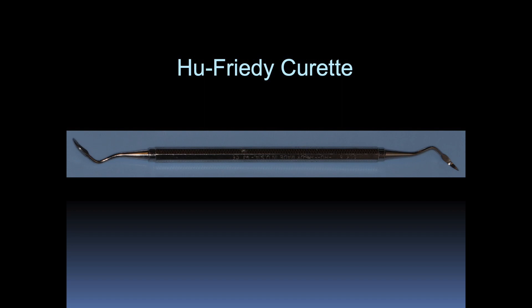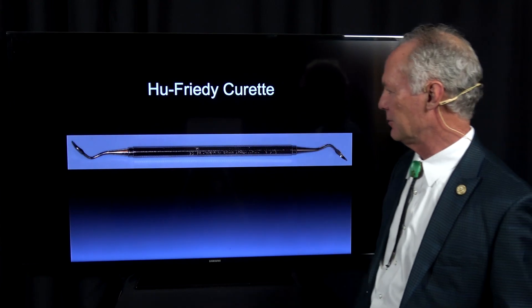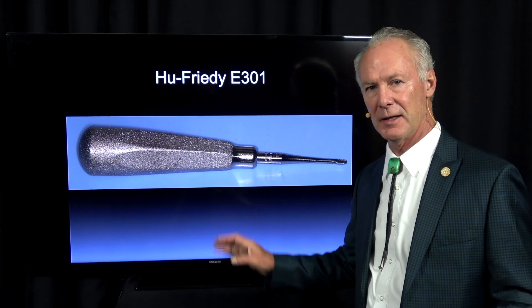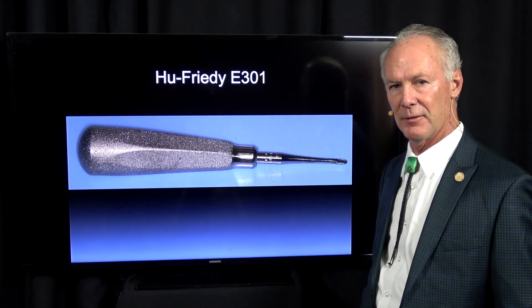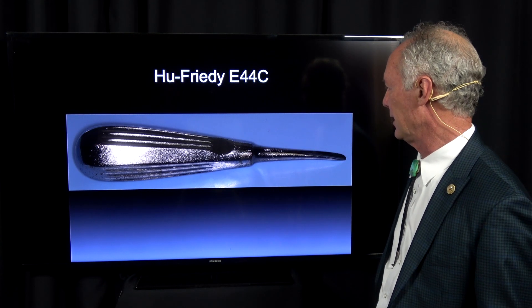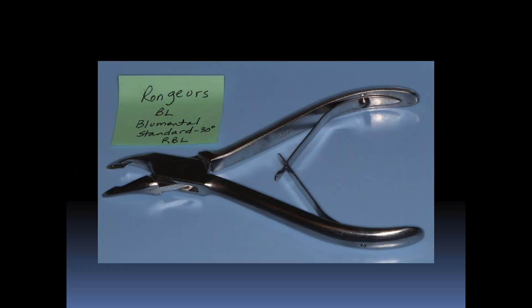This is a curette. It has a tip with a cutting blade, so it's good for removing tissue between teeth. This is a 301 elevator — you can't live without this. It's fantastic for elevating roots or elevating a tooth. This is a larger version of that, the E44C elevator. And then this is just a periodontal elevator for reflecting the periodontium.